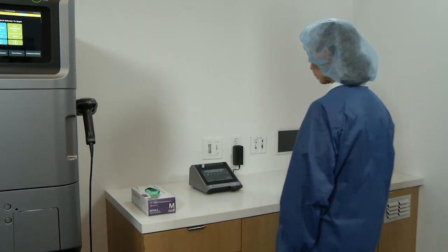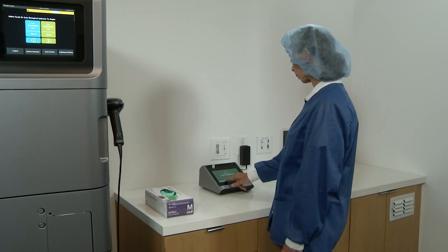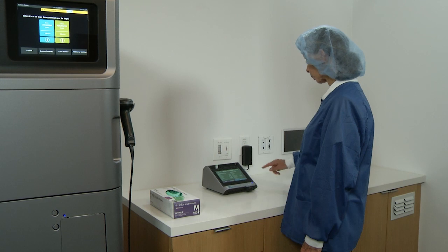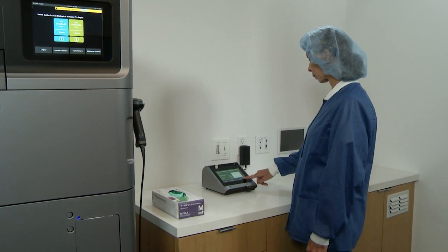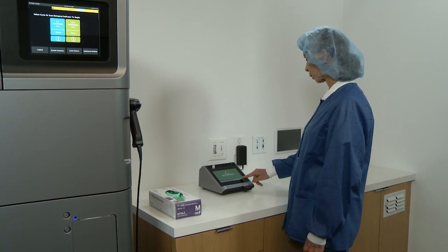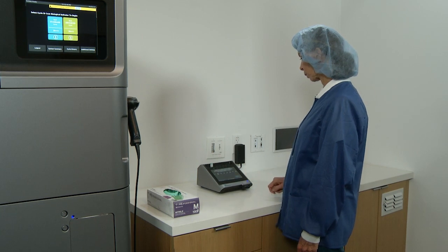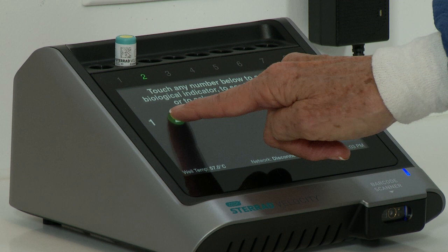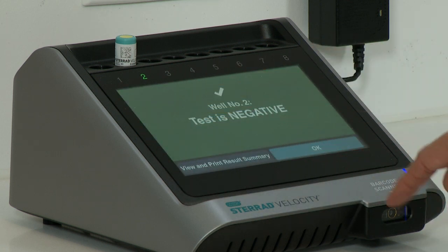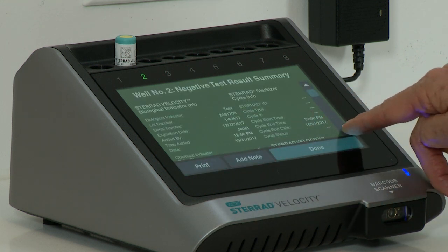A negative result on a test BI is indicated by a green well number. This result signifies that a sterilization condition was achieved, which is sufficient to kill at least one million of the most resistant identified bacterial spores in the BI. Test BI results are only valid with positive control results. To view the result confirmation, touch the green well indicator number or remove the BI from the well. For additional details or to add notes to the BI record, touch View and Print Result Summary.